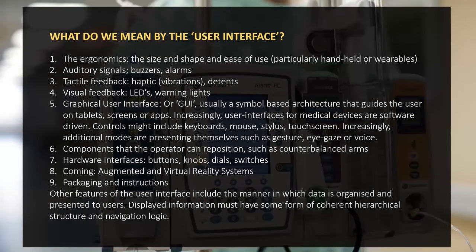So user interface is a very broad term, and there are a lot of components that are part of a user interface. So the ergonomics, which is the way that human beings interact with a device, could be the size, shape and weight of a handheld device, what auditory signals, buzzers, alarms, tactile feedback, haptic, it could be a mechanical detent, what visual feedback we give the user, which is maybe LEDs.